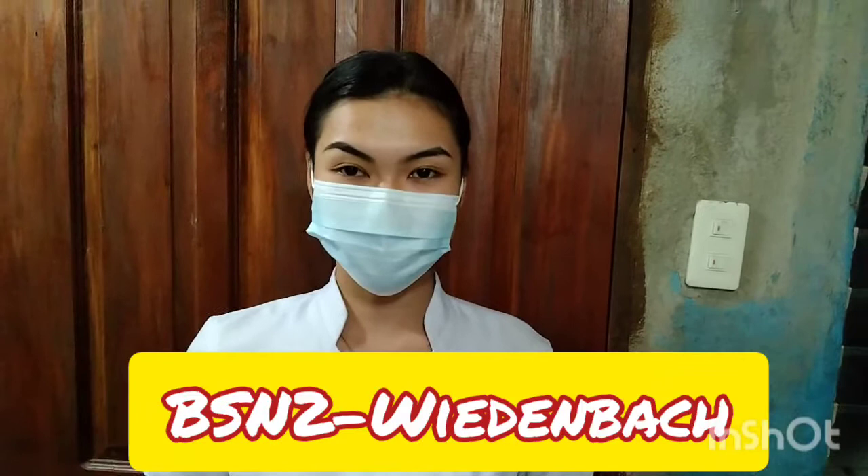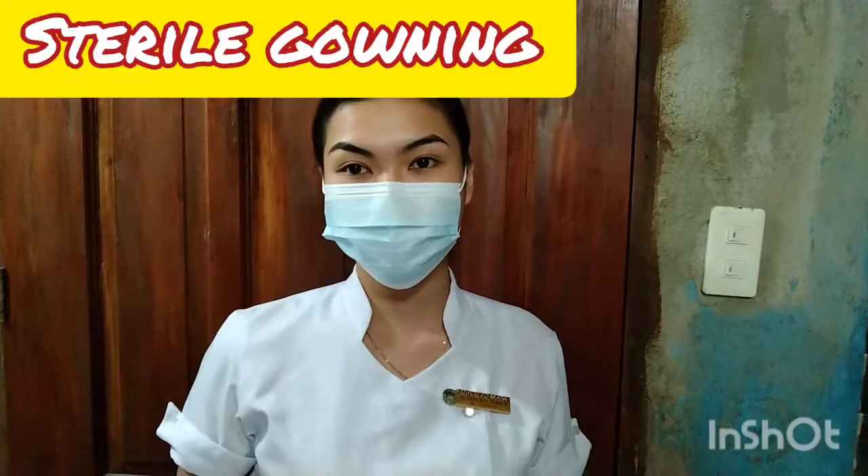Hi, good day. My name is Matthew Ambivaling from BSN to Widenbach. For today's video, I am going to show you the procedure about sterile gowning and closed gloving technique.